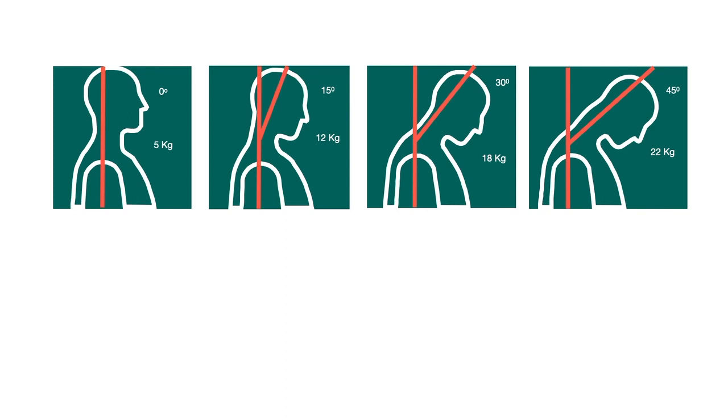If we bend 15 degrees, it is 12 kilograms. If we bend to 30, it's about 18 kilograms. If we bend to 45, it is about 22 kilograms.